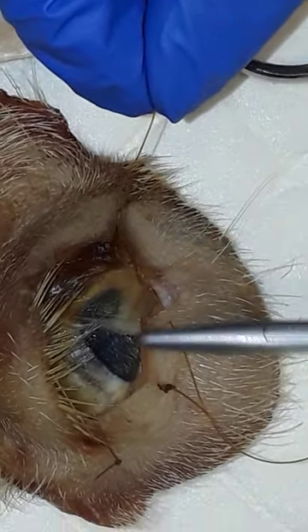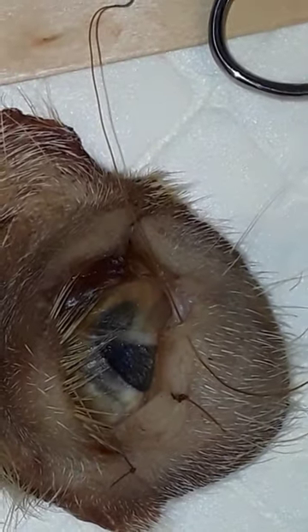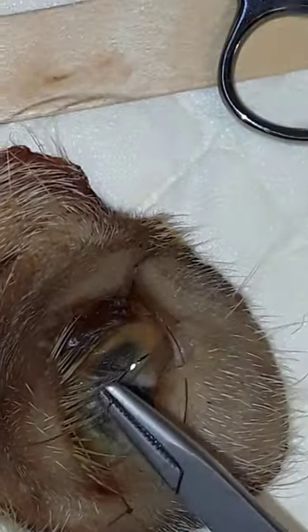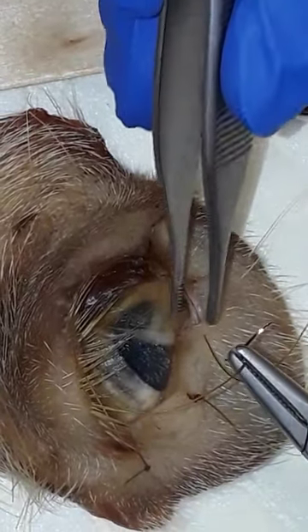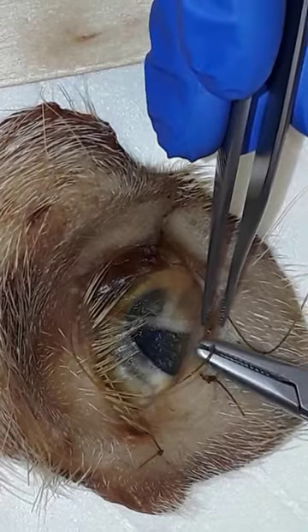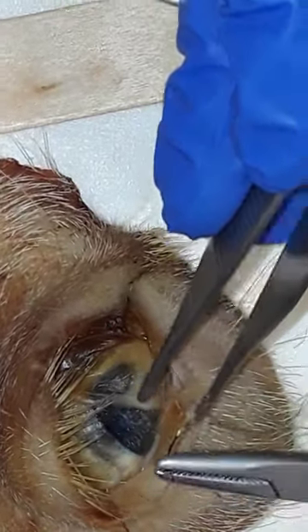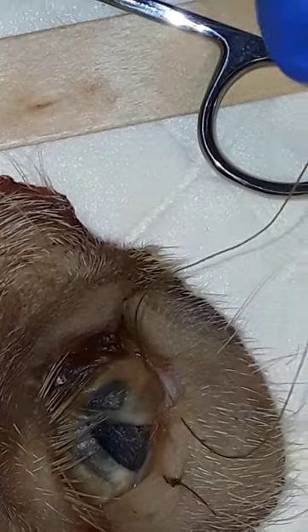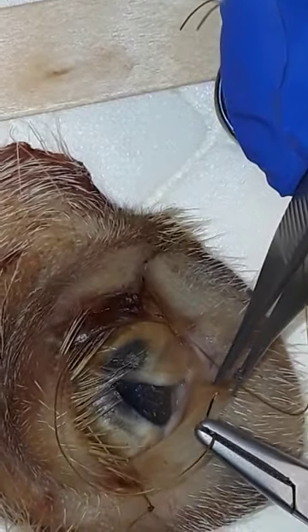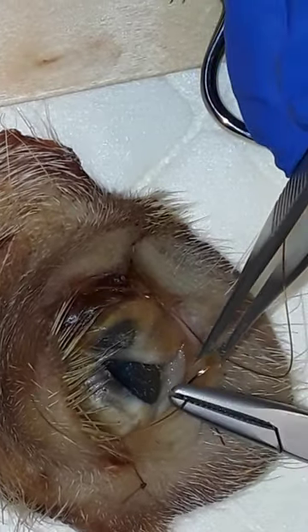I'm going to do the same thing on the other side but in reverse order, mirroring it as best as possible. The more symmetrical you are, the better it's going to be. So starting at the eyelid margin, crossing the defect, entering the meibomian gland opening, and coming out of the cut end. This is a desiccated eyelid margin so I'm using a little more force than I normally would in healthy live tissue.